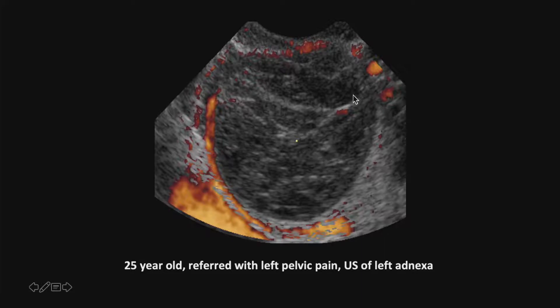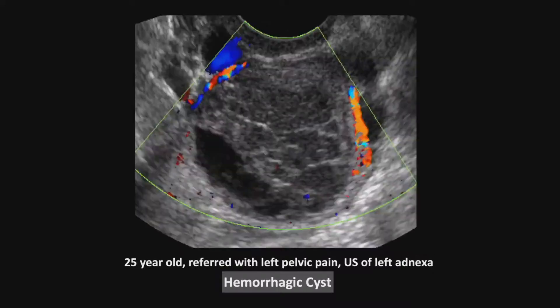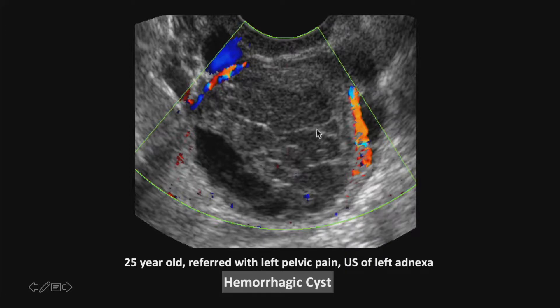So we asked the patient to come back. This is a classic hemorrhagic cyst. Here's the same patient on follow-up, and you see that this blood clot is starting to retract. So you have a fluid-solid level, and this reticular lacy pattern that you see inside is very characteristic of a hemorrhagic cyst.